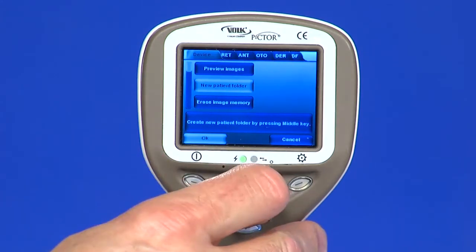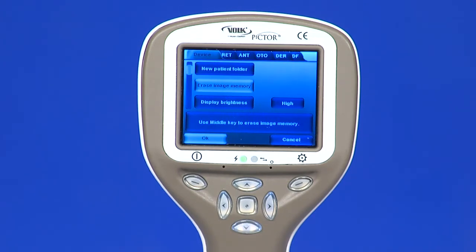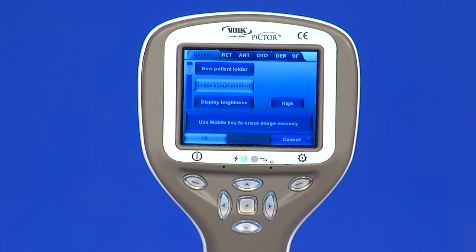Erase image memory: image memory can be erased by selecting erase image memory. This selection is activated by pressing the middle key. The camera also prompts the question erase image memory when the camera is powered on or removed from the cradle.